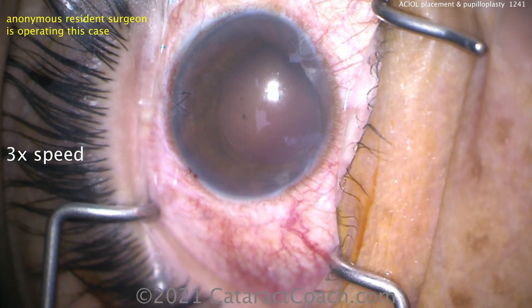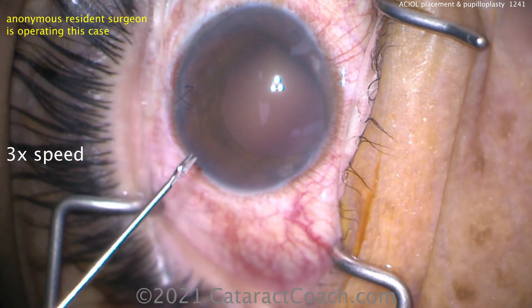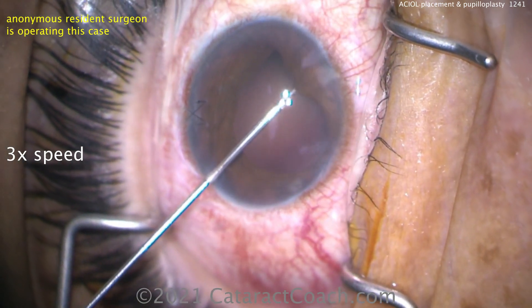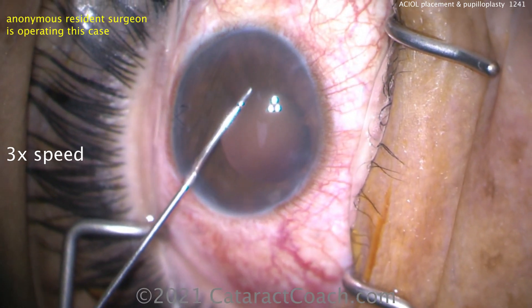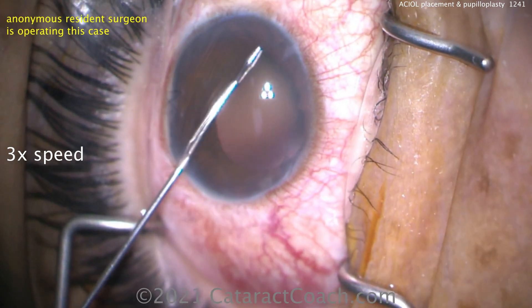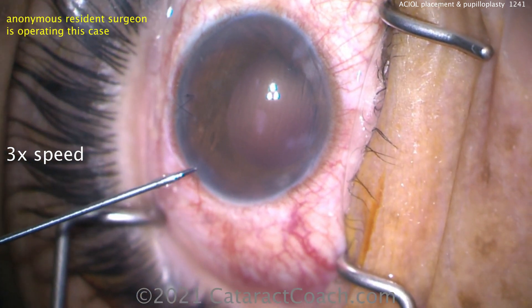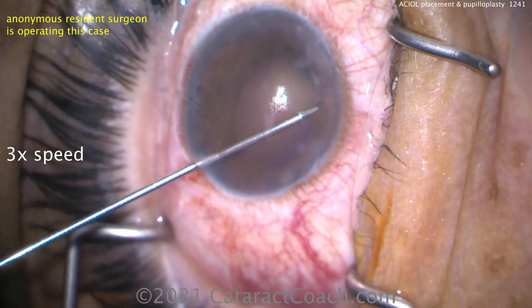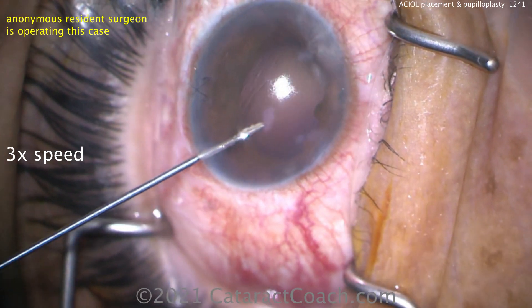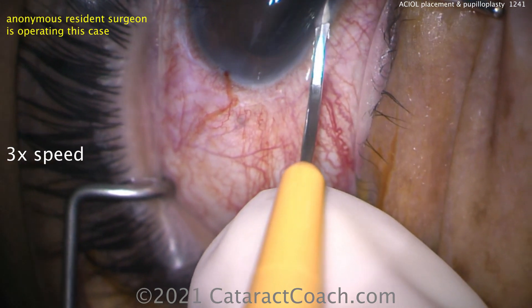Here's the case: the patient already had a complete pars plana vitrectomy. This patient had an intraocular foreign body which damaged the inferior iris and the lens, and ended up in the retina. So this patient had a lensectomy and a full vitrectomy, and now it's time for an IOL. There's that inferior PI — the patient had that after prior retina surgery.